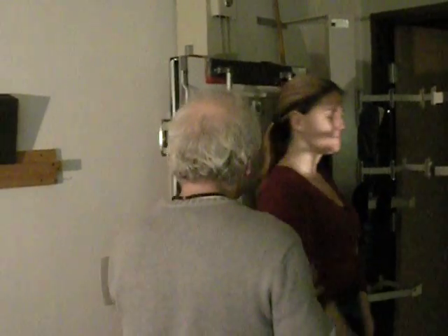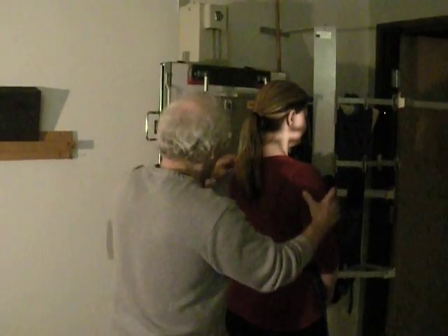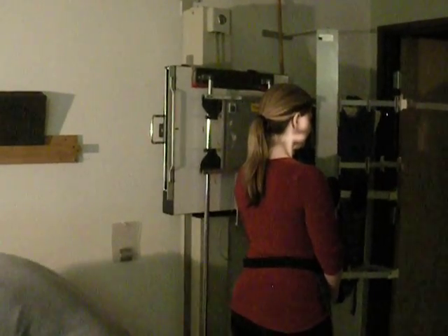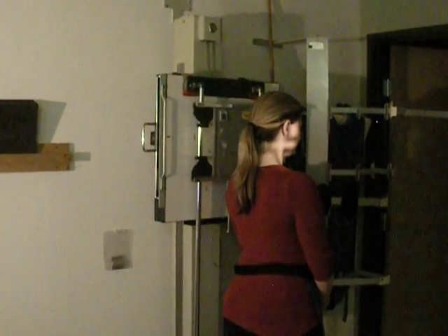Now I turn the patient to the side. And miraculously, she's the same height facing this direction as she was in the other. And for demonstrational purposes, I think I'll just cut this ponytail off. No, I'll just ask her to hold some weight to pull her shoulders down. Here, have a weight. There you go.